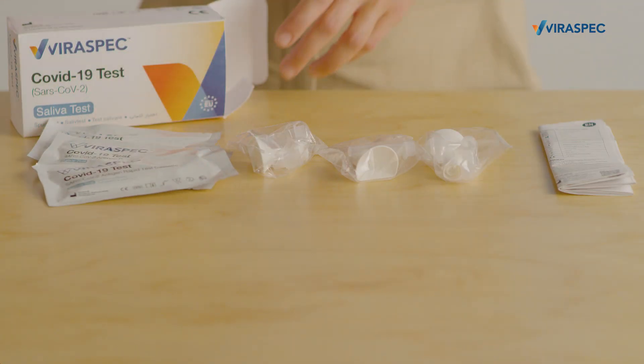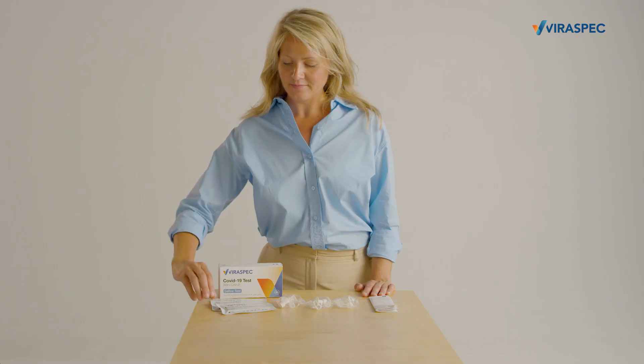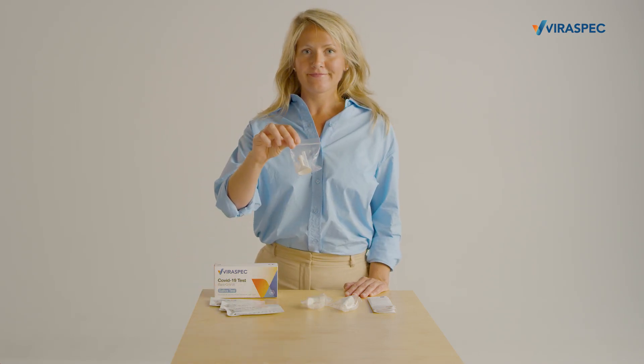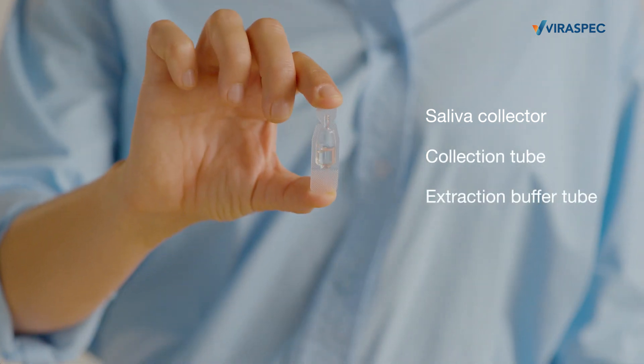The box contains three test kits and an information leaflet. To do a test you need one of the test cassette packages and one of the accessory bags, which includes a saliva collector, a collection tube, and an extraction buffer tube.